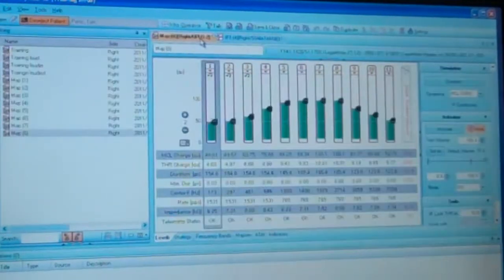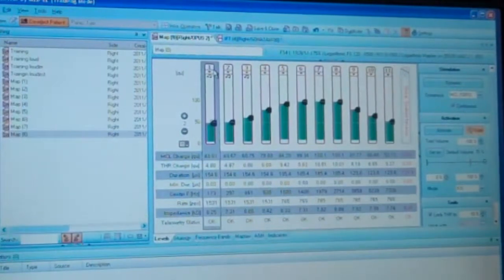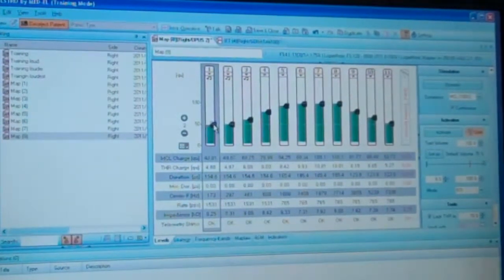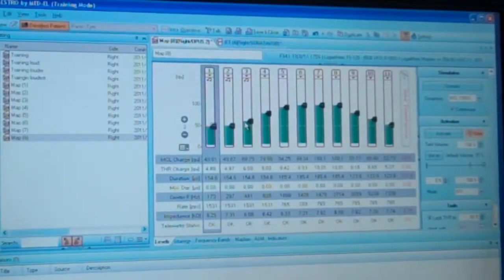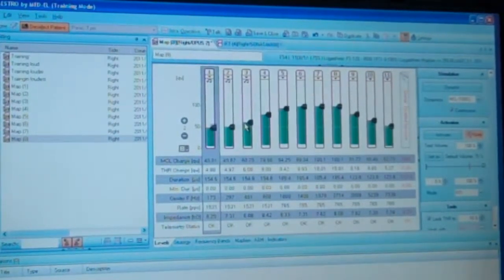Once we've done that, we go into the programming software — you can see the 12 electrodes again — and we ask the patient to do a mini hearing test on each electrode. We ask them to tell us when they first hear a sound, which is called the threshold measurement, and then when the sound is loud but still comfortable for them. We do that for each electrode, which gives us a range over which they'll hear sound. We save the programs and then have the ability to make minor adjustments depending on which environments they're in — for example, if they play sports or work in a lot of noise, we can adjust levels and other parameters to allow them better access to sound.